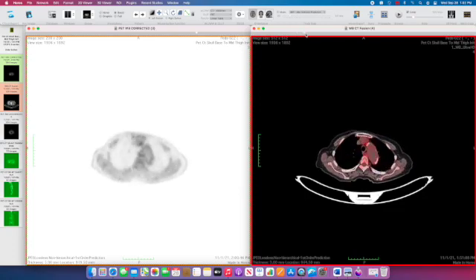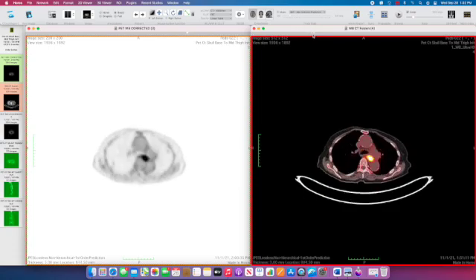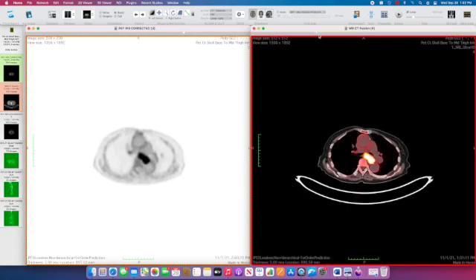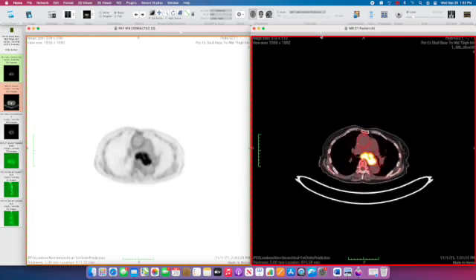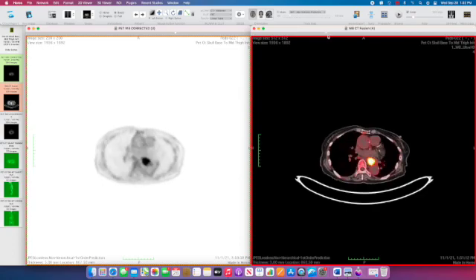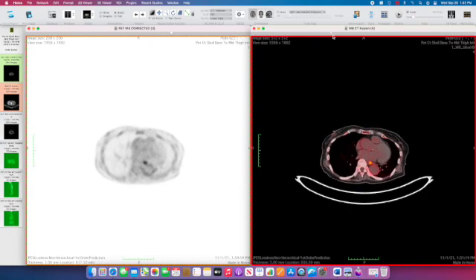A little bit lower down there's a right paratracheal lymph node. And then in the middle of the chest we have this large very hypermetabolic mass inseparable from the esophagus and certainly suspicious for a mid-esophageal cancer.